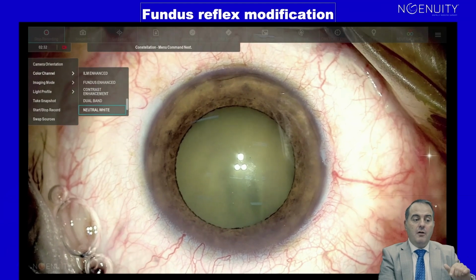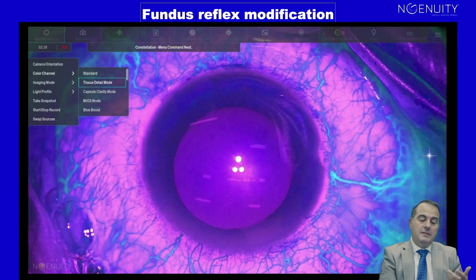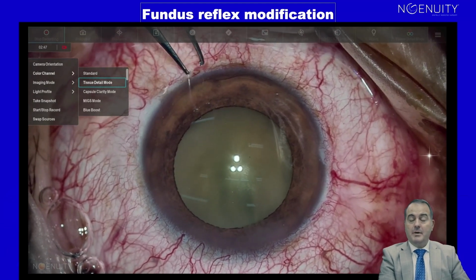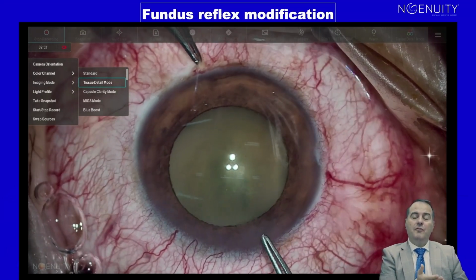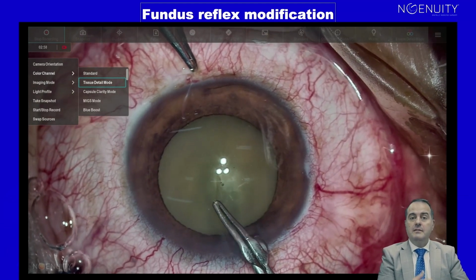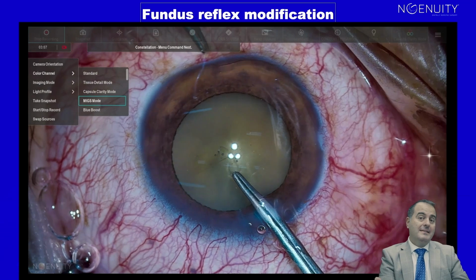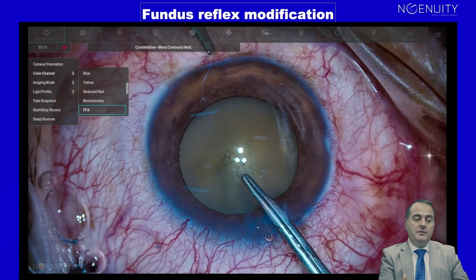So here, this is how we are doing the rexis without using a dye. This is the beauty of the digital color filters. We reduce usage of the dyes in the eye, which arguably is beneficial, of course, because at least a single TASS syndrome can be avoided if the staining agent is not good enough or something is compromised during the loading of this staining agent. So less dyeing, less danger of TASS syndrome, and less toxicity.